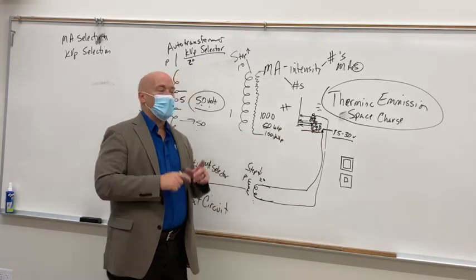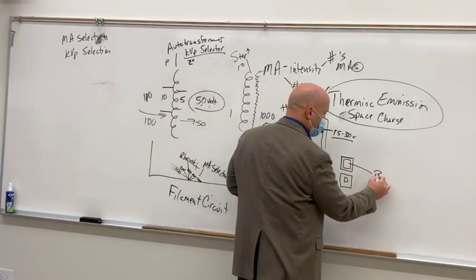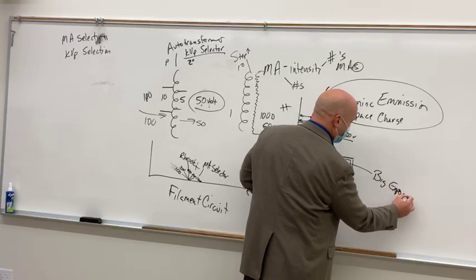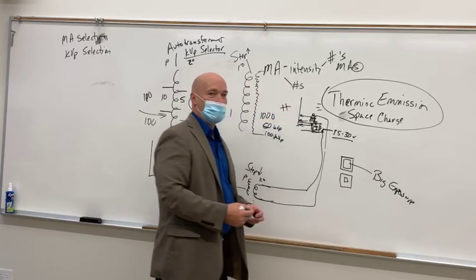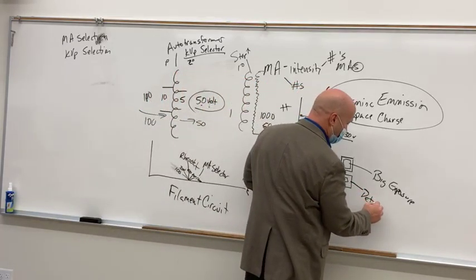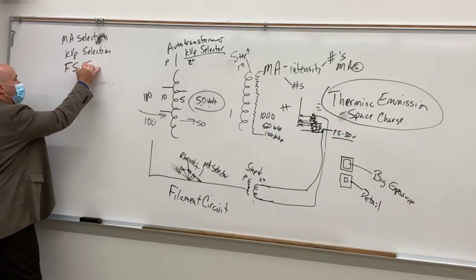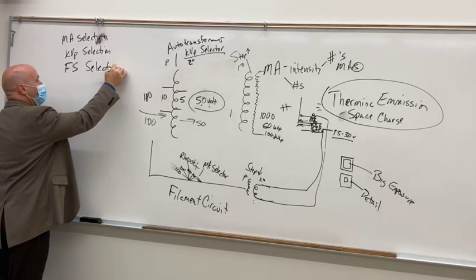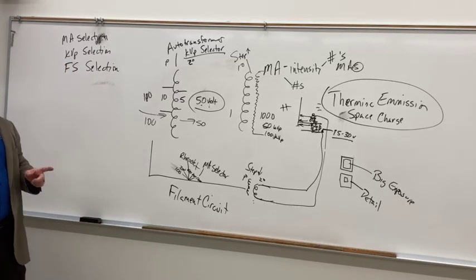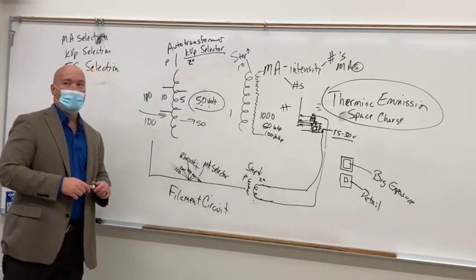Burn it up, right? So what I'm going to use that for is big exposures, where I'm not really interested in seeing extremely high detail. What I'm going to use this for is for detail. So we've got focal spot selection as well.